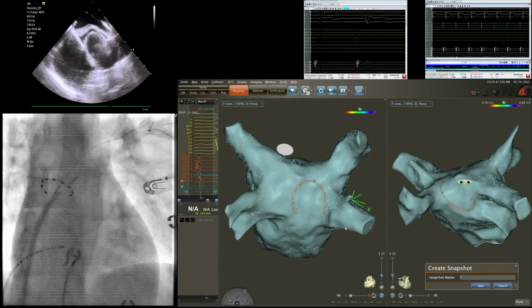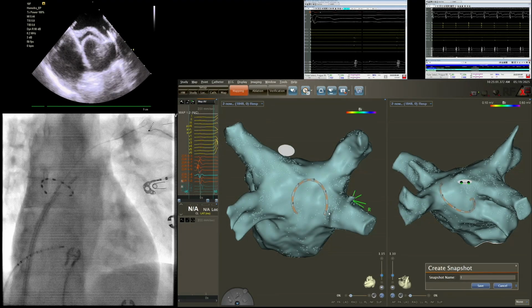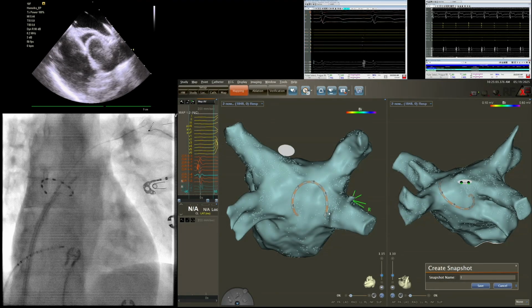What I really tried to make you happy, Peppo, is that we did ICE catheter. And Toshi is here, Ken is here, Pavel is here. So we have a paroxysmal atrial fibrillation patient with 4 operators. Maybe they will join us as well. So we'll be like a really strong group here.